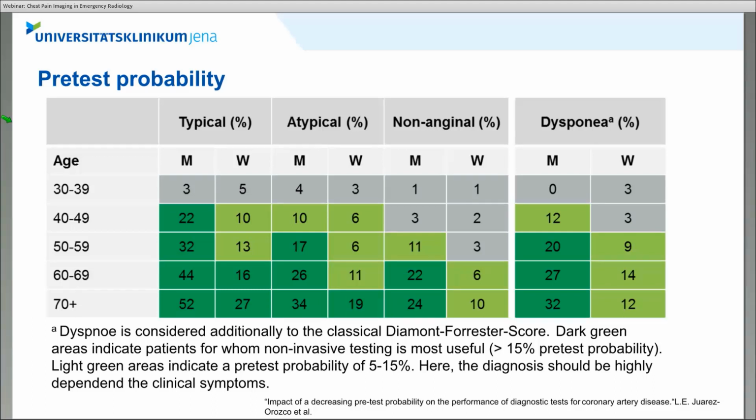And this has completely changed the world for us. We already did a lot of acute scanning before in the emergency department, but now ruling out CAD comes nearly as often as our rule out for pulmonary embolism, probably the same incidence. This has completely changed only because the pretest probability is now much lower in the guidelines. And the interest of our cardiologists in using CT to rule out coronary artery disease is so much higher than before.